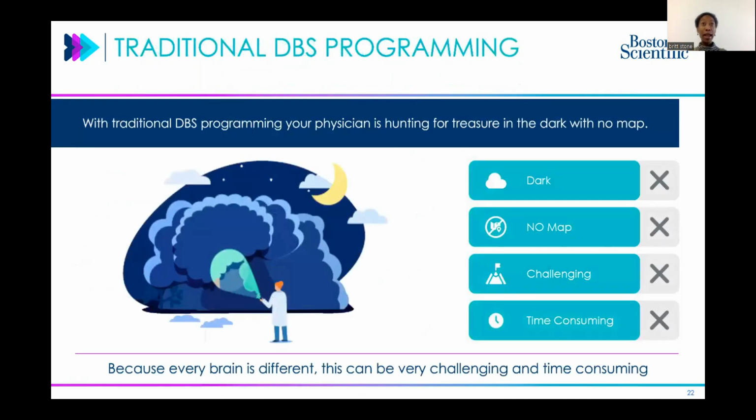Before, and how I was trained with DBS, we used imaging to know where the leads are placed. Yes, the neurosurgeons did this. As a neurologist, often I wouldn't be privy to seeing where the lead was, besides on an MRI or a head CT. And that helps if it's something really off course, right? Or like, oh, okay, this seems to be the right place.